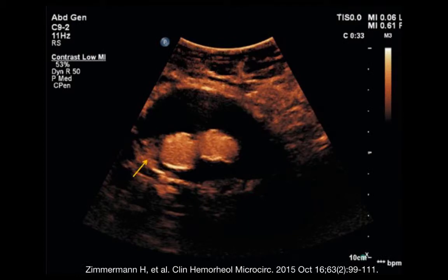Anyhow, in regards to abdominal aortic ultrasound, this can be really useful in the diagnosis of endo leaks. So this is a patient with an endograft in place that's received contrast. So you can see the aneurysmal sac here and the endograft here, and there is contrast. There are microbubbles outside of the endograft, meaning that they have an endo leak. This is used at times when patients are having their endografts evaluated with ultrasound, but the more comfortable we get with contrast is something we can do at the bedside quickly and easily, potentially in the future.